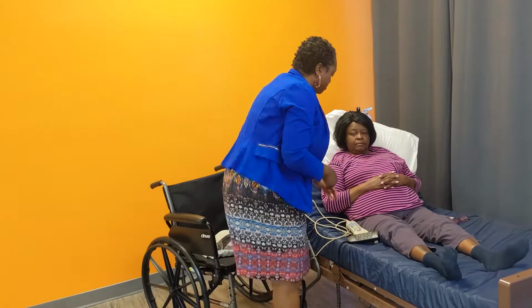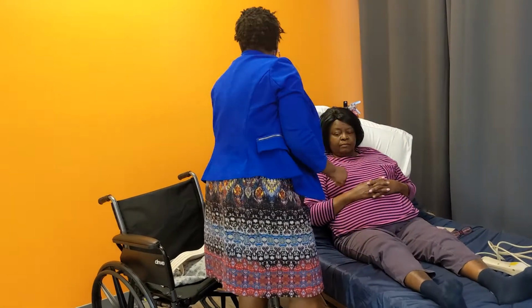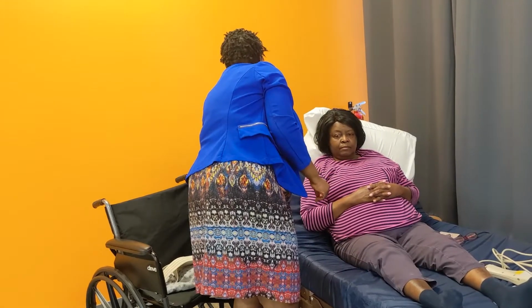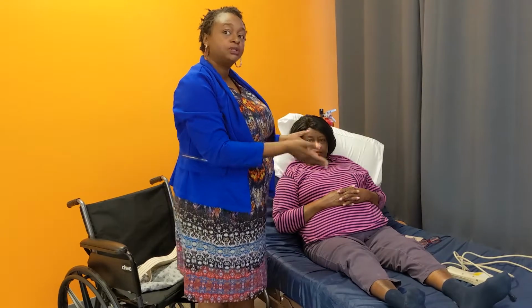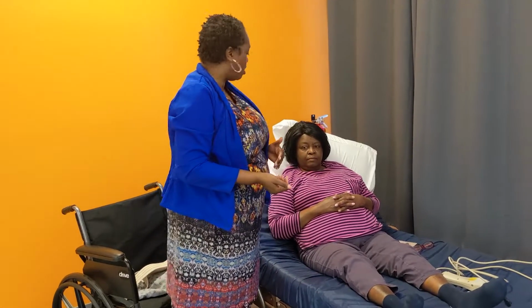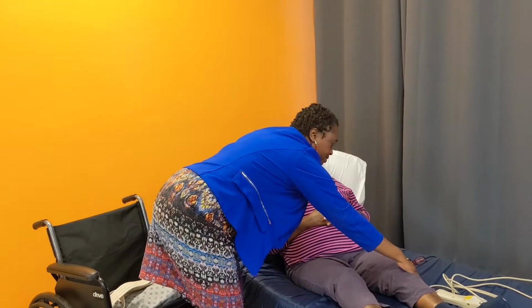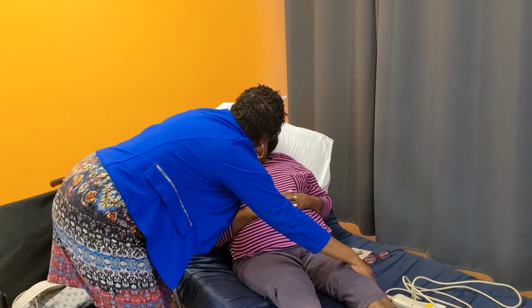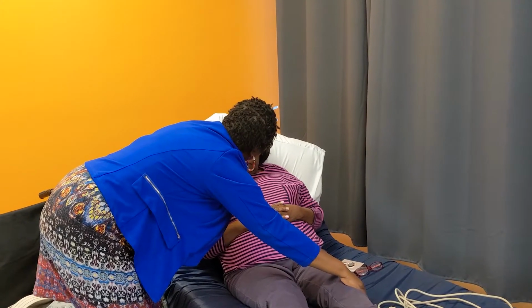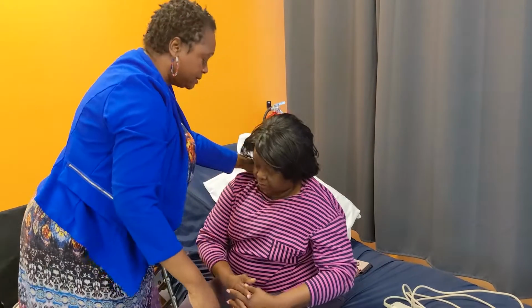So now I'm going to use proper body mechanics, move certain things out of the way, and help get her to a sitting position, okay? Remember, we never tug and pull the patient's arm. So I'm going to reach behind her neck here. I'm going to put two hands here. Louise, I'm going to help you sit on the edge of the bed on the count of 3. 1, 2, 3. Okay, now it's a pivot.